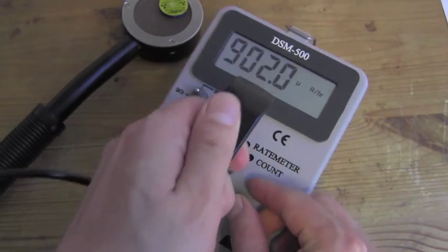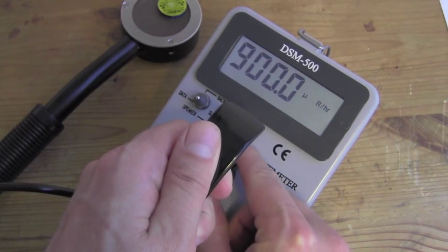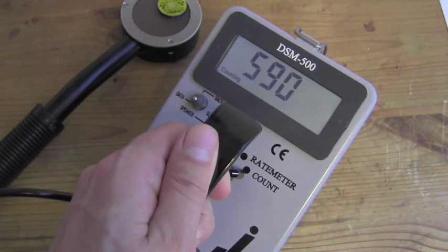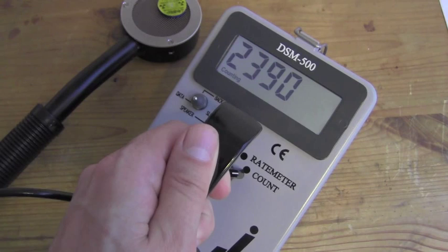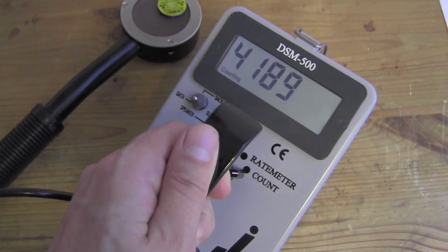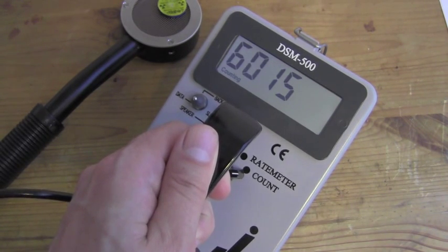We are going to turn the dial to count. It will zero itself and give us the total in approximately 60 seconds.